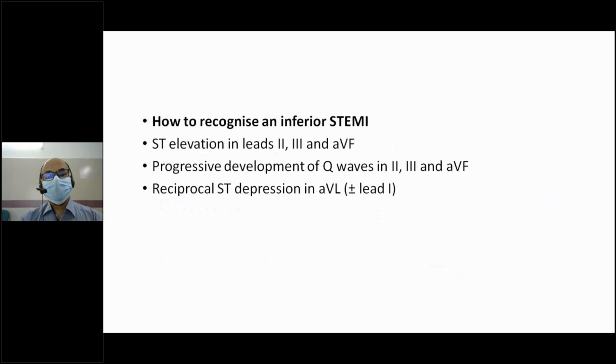So how to recognize it: ST elevation in leads 2, 3, aVF. Progressive development of Q waves in 2, 3, aVF. And sometimes reciprocal change, ST depression in aVL as well as lead 1.